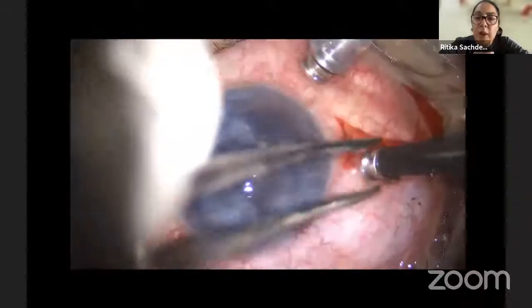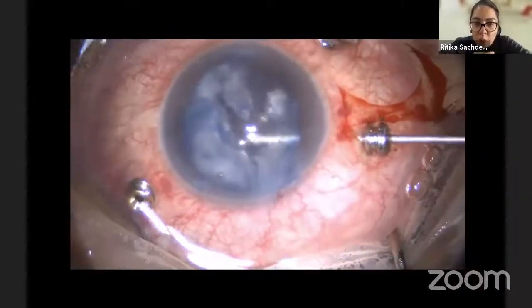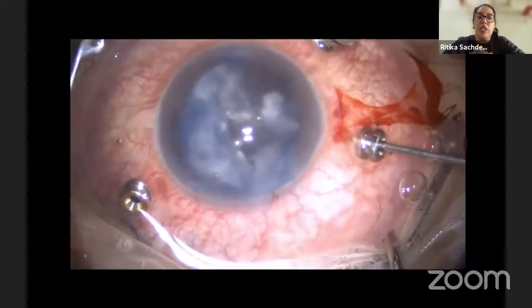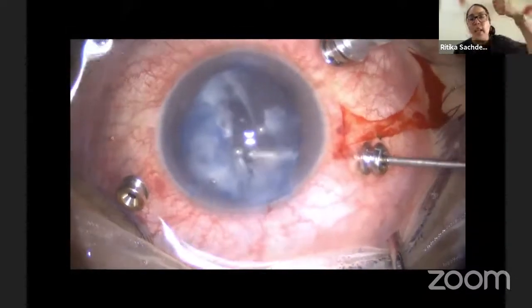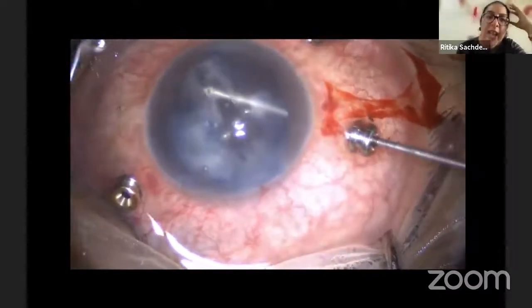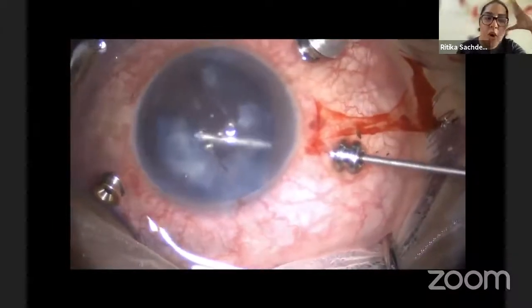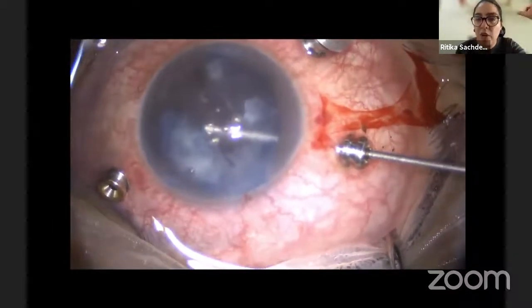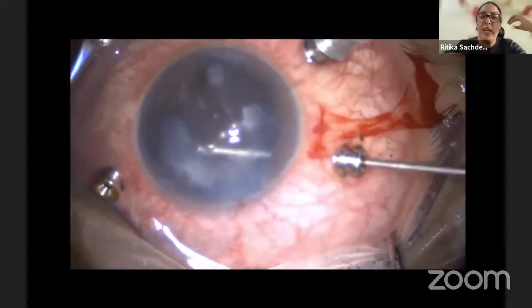When you go in through the pars plana, they call it bringing the vitreous back home. You're going in from a posterior location and pulling the vitreous back. So when you don't pull anything up front, you don't cause more vitreous to herniate. And this is a safe way of reducing the expansion of a rip in the PC that is already there. So the capsular tear does not extend and an effective vitrectomy can be done.